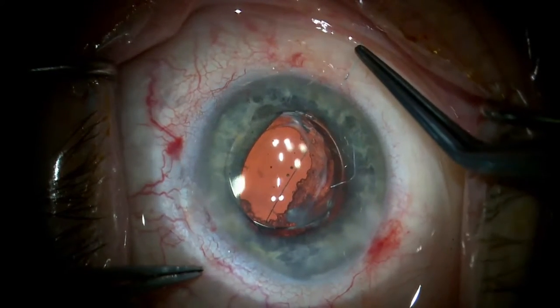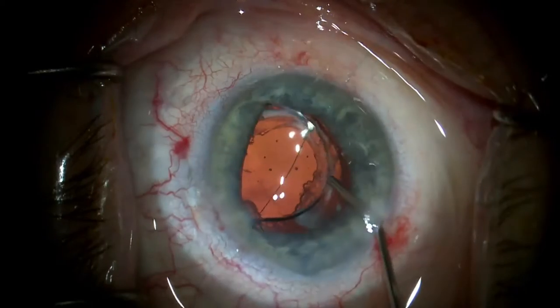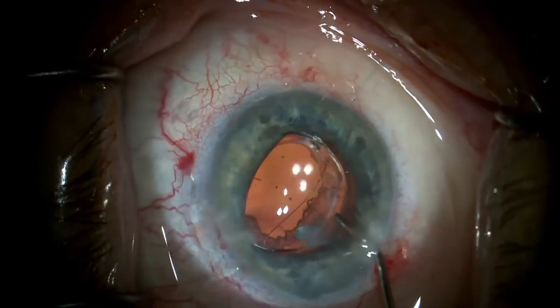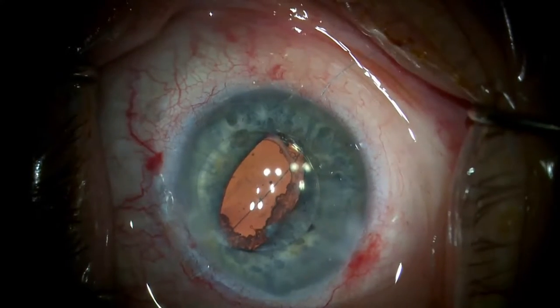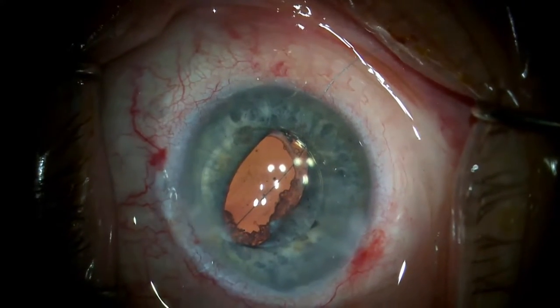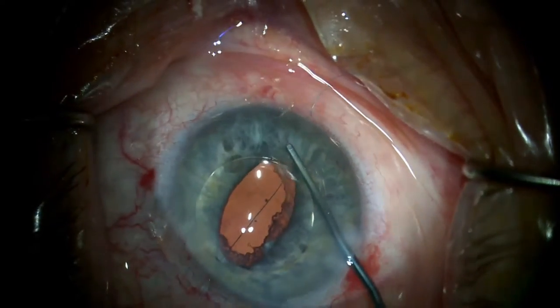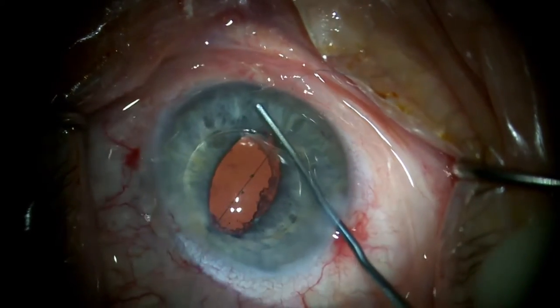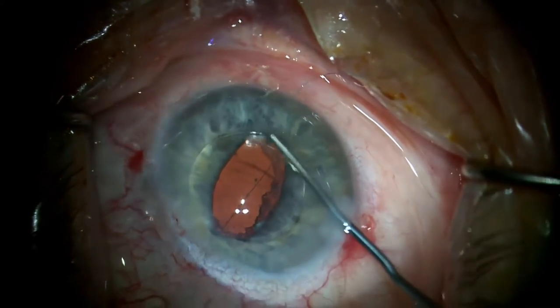With the suture in place, it is possible to lift and maintain the optic anterior to the iris while acetylcholine is injected into the anterior chamber to constrict the pupil and achieve anterior capture of the optic by the pupil. The iris is then massaged centrally to better access the more peripheral part of the iris prior to placing the fixation suture.